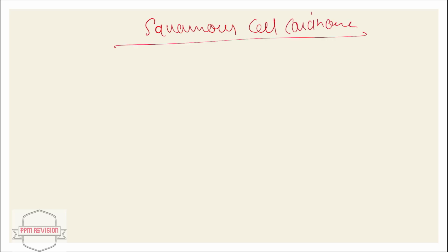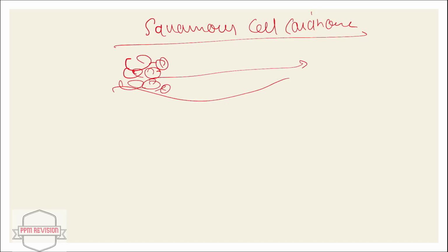The very important point here is, we can just draw cells, and there is downward proliferation of cells. So that is what we are seeing here, there is downward proliferation.